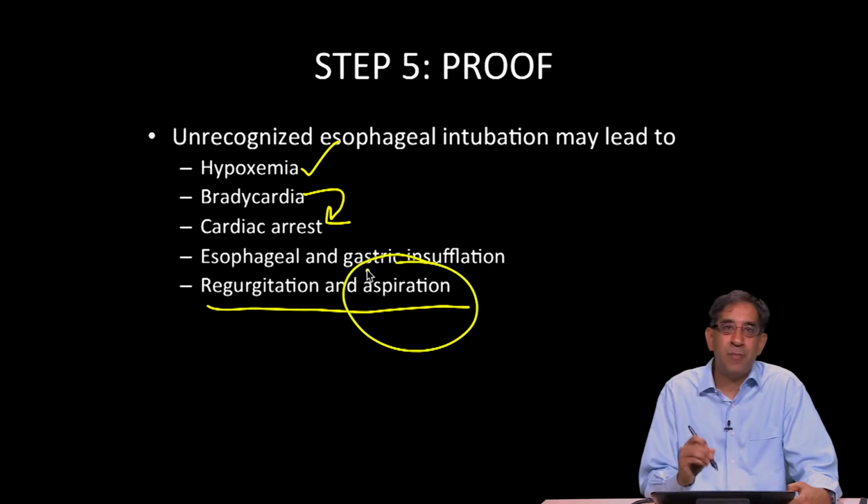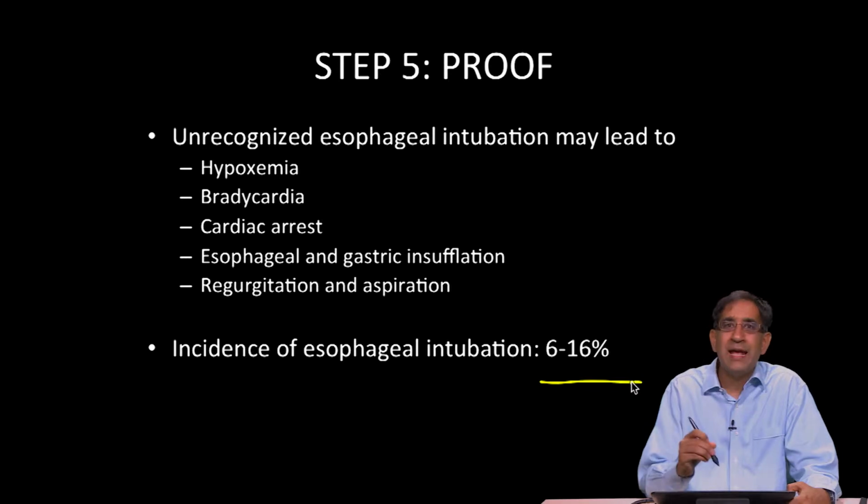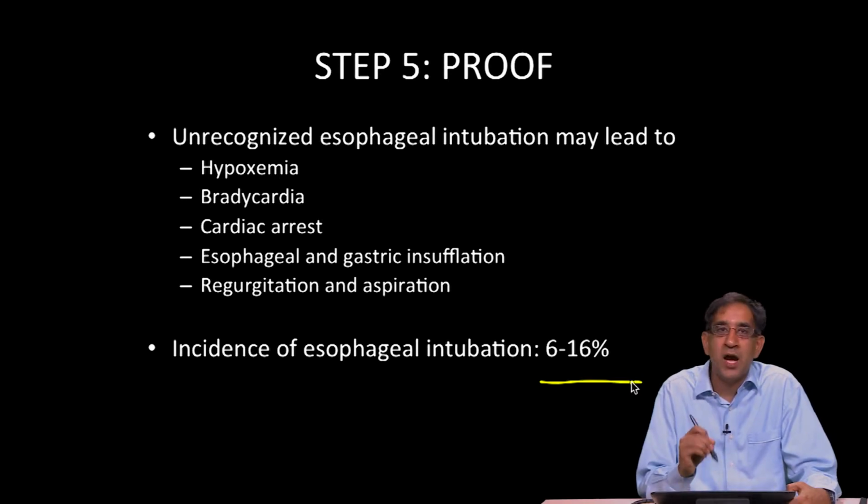All of these things are bad. All of these things are complications of esophageal intubation. And as I mentioned before, it is going to happen. It's unavoidable. It occurs in anywhere from 6 to 16% of emergent endotracheal intubations.